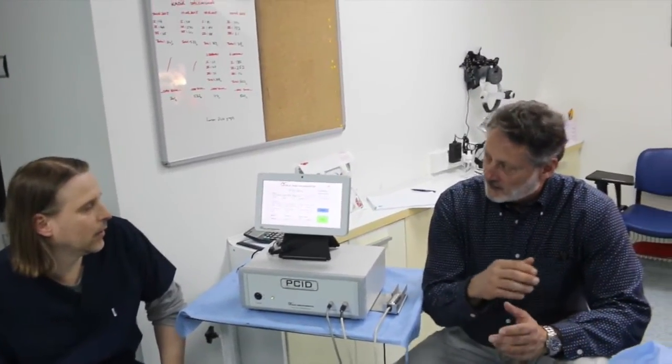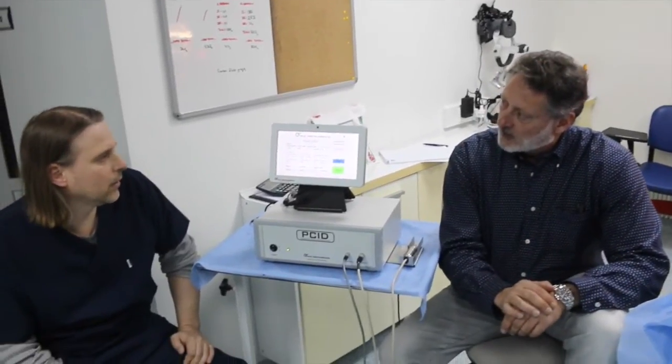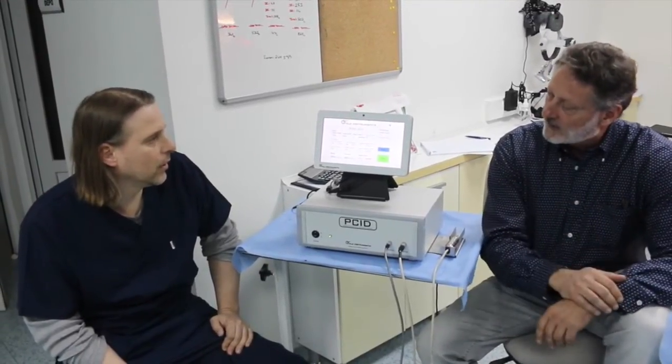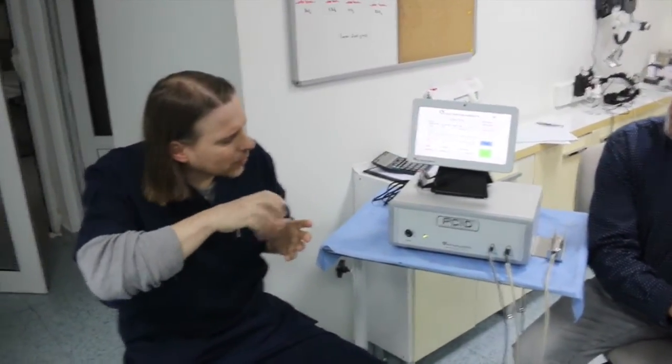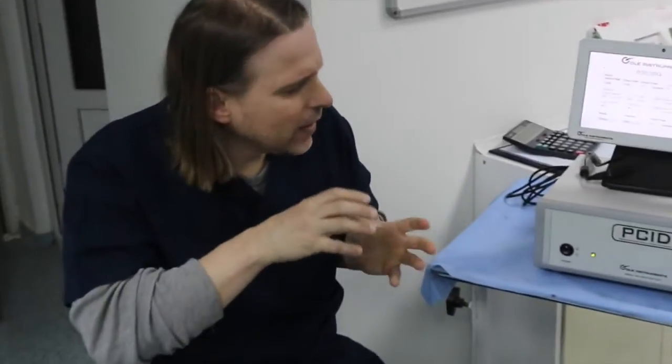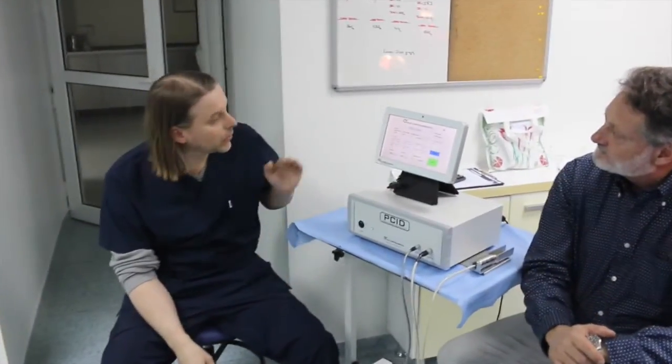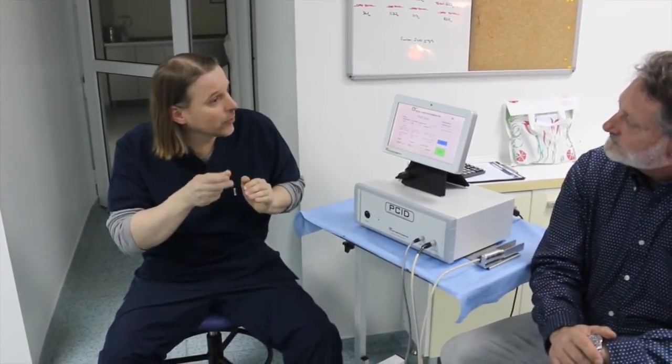You can also vary not only the rate of oscillation but also the angle of oscillation. My feeling is the bigger the angle, the closer you come to rotation, and in rotation you always have the spin — the danger of spinning and grabbing too much. I tried many different angles, but the best, most similar to manual extraction, I find is 100 degrees. Of course, this might vary from one patient to another.